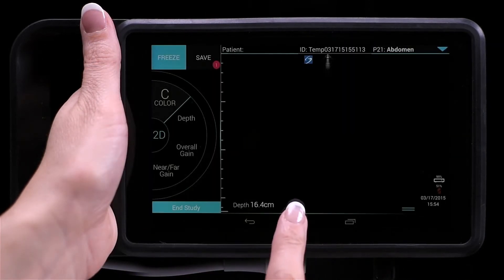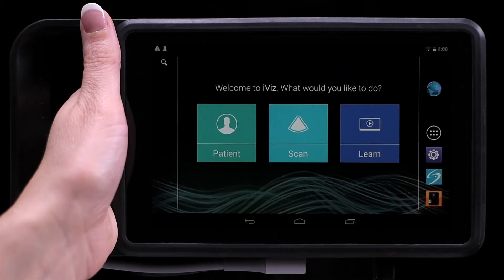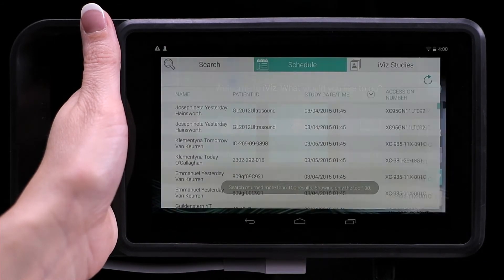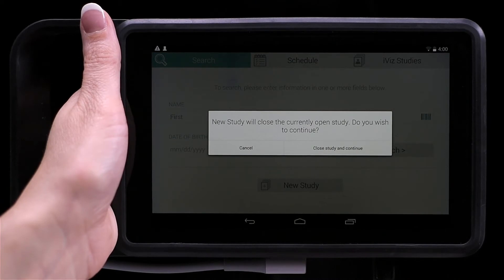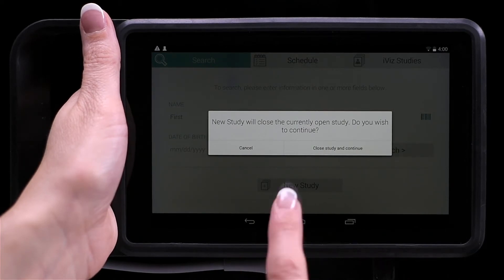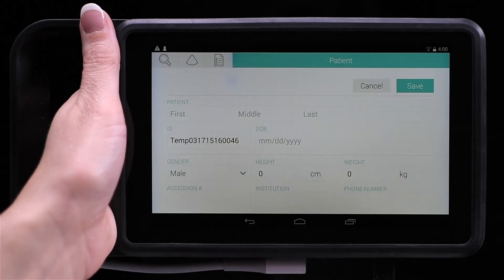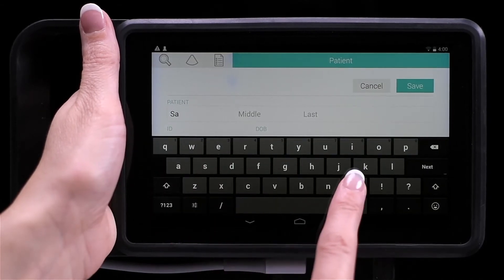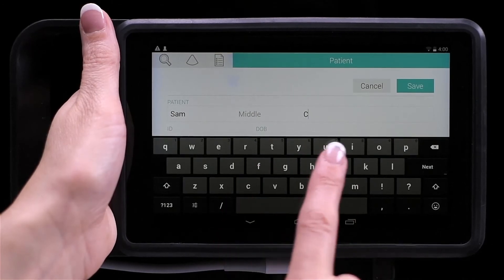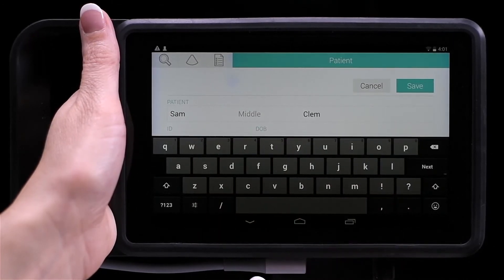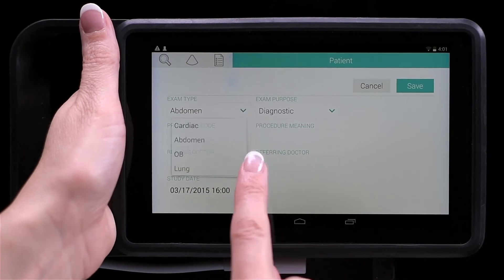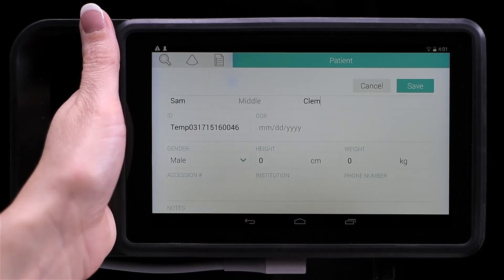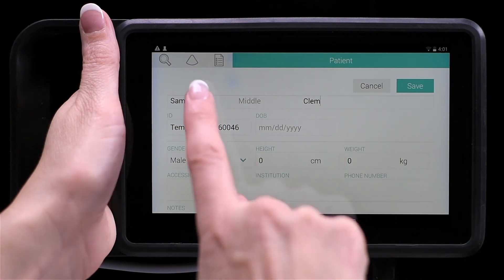To start a new study from the search menu, from the home screen, tap Patient. From the search tab, tap New Study. Notice that iViz prompts you to close the current study before starting a new one. From the patient screen, type the patient information in the appropriate fields. To close the keyboard, press the down arrow. Scroll down to make sure you've entered all the necessary information. Tap Save or the scan icon to save the patient form.